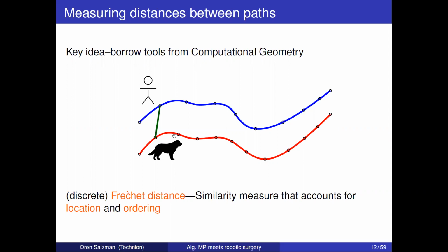Okay, so in a sense, it's a proxy to say that you do not allow backtracking. It's a proxy to saying, so I want the blue to be close to the red to be close to the blue, and that there's a monotonicity in progressing. Okay. So that I get. Okay, fine. Thank you. No problem.